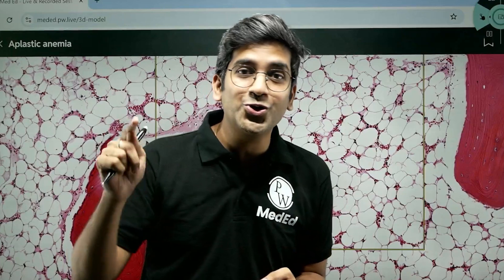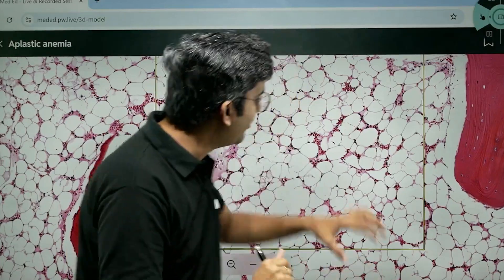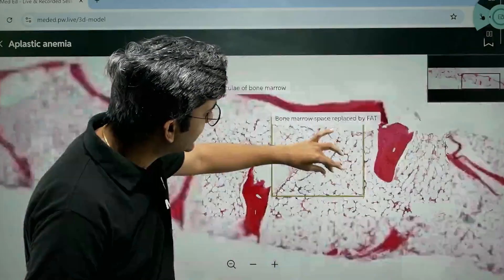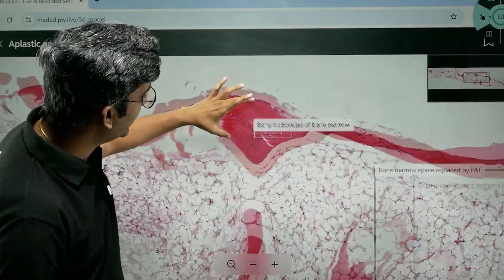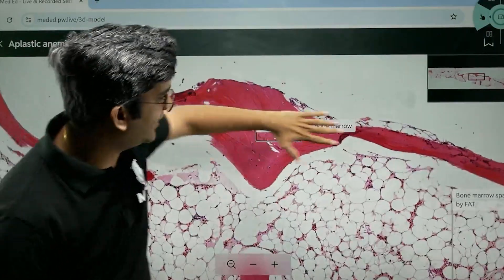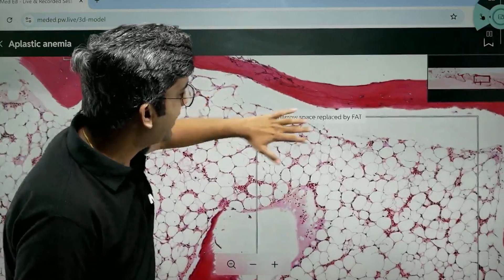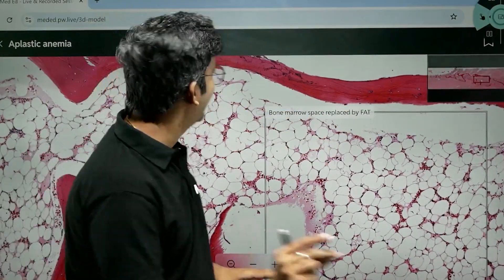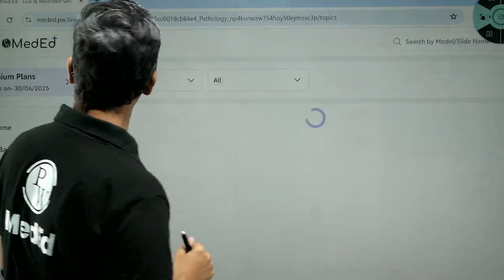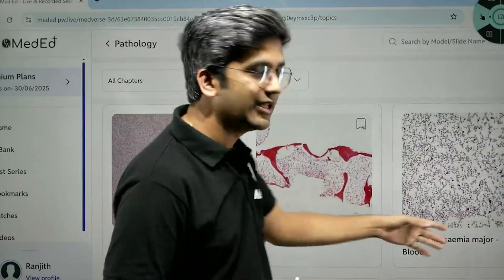Hereafter, you need not go to Google and see just one image of aplastic anemia — here you can see the entire slide. Not just that, it's marked for ease and convenience of learning: the entire trabecular bone and the bone marrow space replaced by fat are labeled. Let's go and explore one more thing just to make sure it's comfortable and relatable.